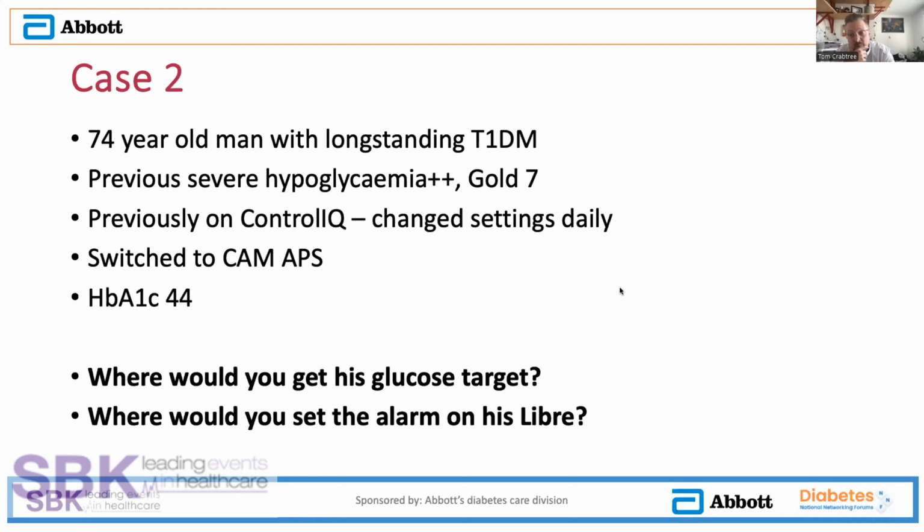So for him, we set him a lower glucose target than you'd probably think for someone with this clinical picture. And his is set at 5 to try and stop him from having to do work when the pump can do it more safely than he can.